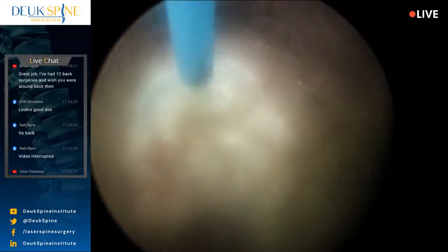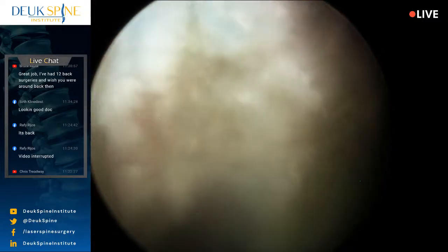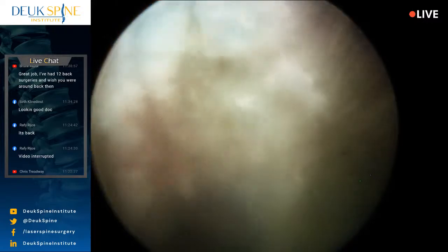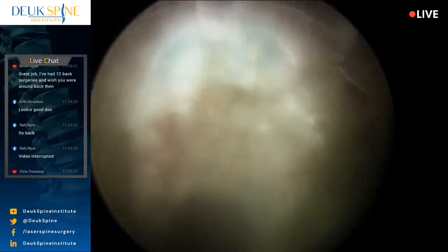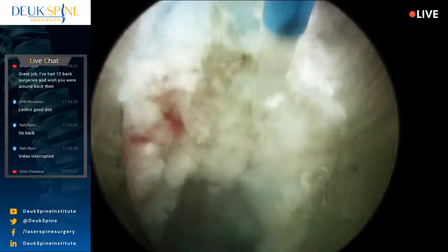We use Decadron usually, Solumedrol, preservative free. All right, I apologize for the cloudiness, but that's just a little bit of bleeding from right there where there's some inflammation that was there.